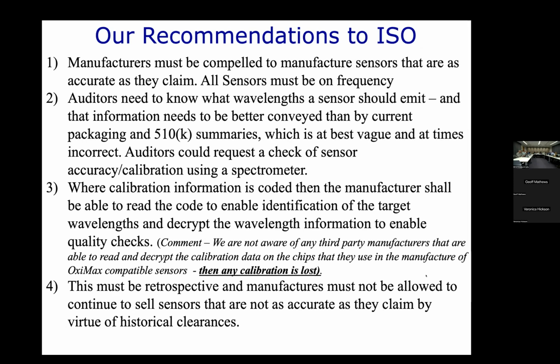Auditors could request a check of sensor accuracy calibration using a spectrometer. Where calibration information is coded, then the manufacturer shall be able to read the code to enable identification of the target waves and decrypt the wavelengths.